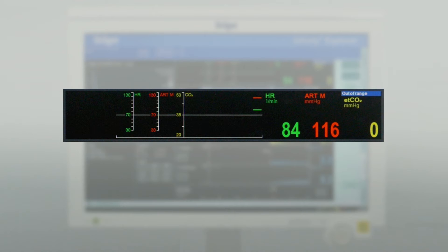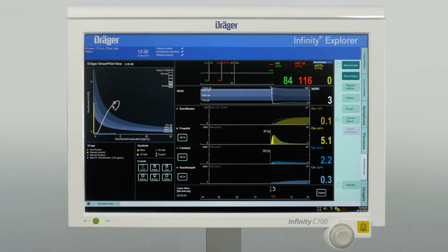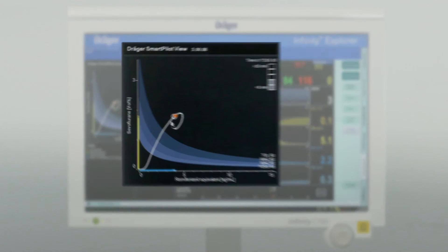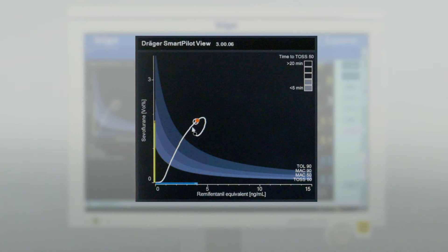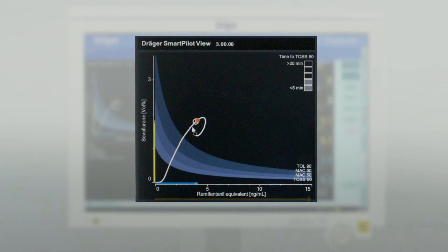Please note the data from hemodynamic monitoring is just displayed but not taken into account for the SmartPilotView calculations. On the left side of the display, you will see the calculated anesthesia level based on interaction models, which displays the entire case as a line with a 10 and 15-minute preview. The x-axis shows the calculated effect site concentration of the opioids, while the y-axis shows the hypnotics, like propofol and volatiles.